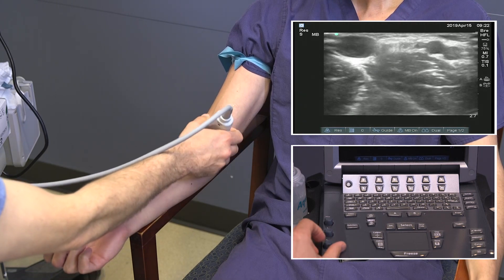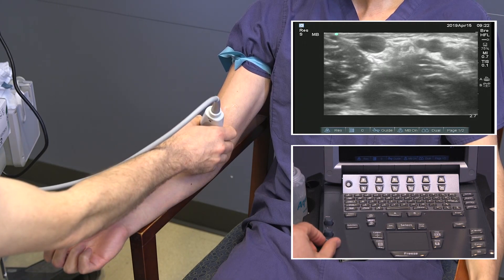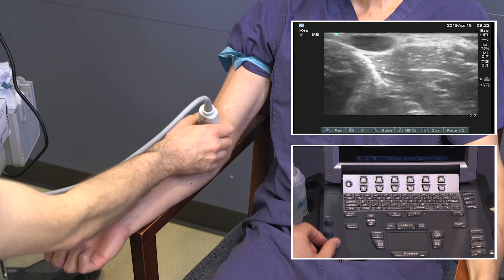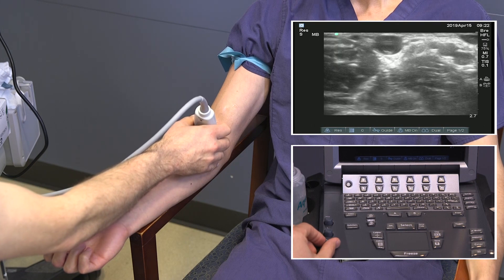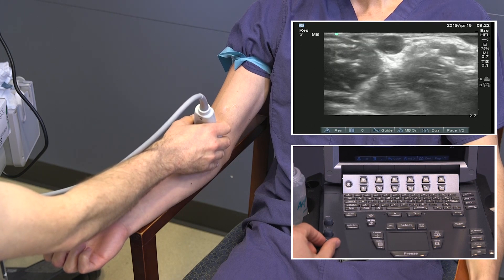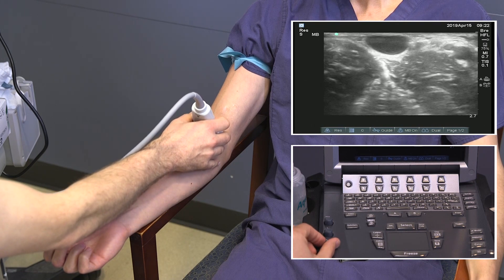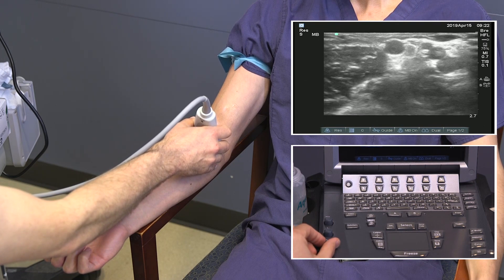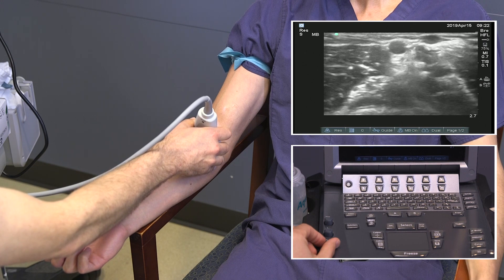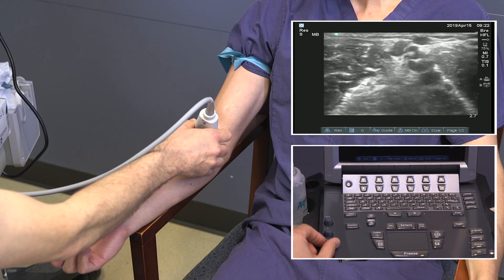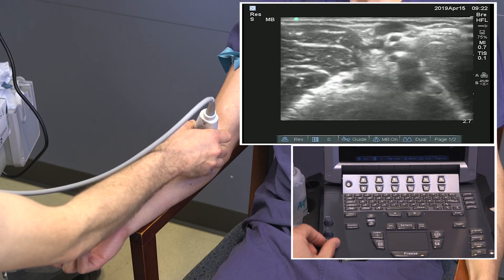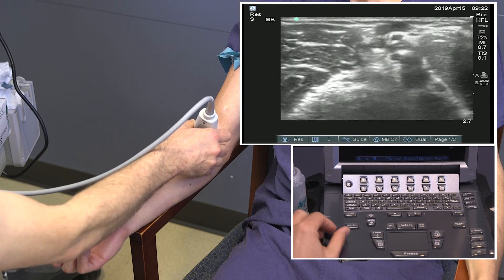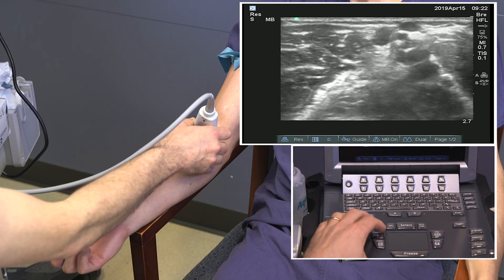Most important for the percutaneous fistula creation is the presence of a perforator and characterization of it. We're looking at the median cephalic vein and following that down. Here we see the perforator vein and the junction with the median cubital vein.